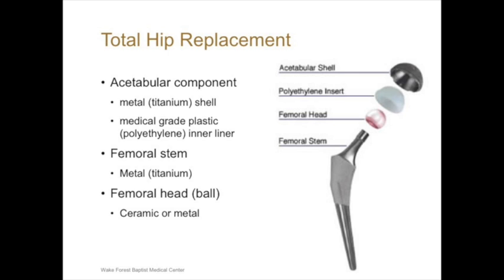The reason we're doing that these days, as opposed to the cobalt chrome metal head which was used historically, is because you hear a lot about metal on metal, and metal on metal historically is the metal head on the metal liner, and that's why we don't use a metal liner anymore. But there are a lot of studies, especially now, talking about metal debris that can actually be created from the metal head on the metal neck of the stem. So that can create metal debris, even though it's not technically a metal on metal hip. That's oftentimes why, especially in younger patients, we use a ceramic ball or that oxinium, which is a different type of metal.